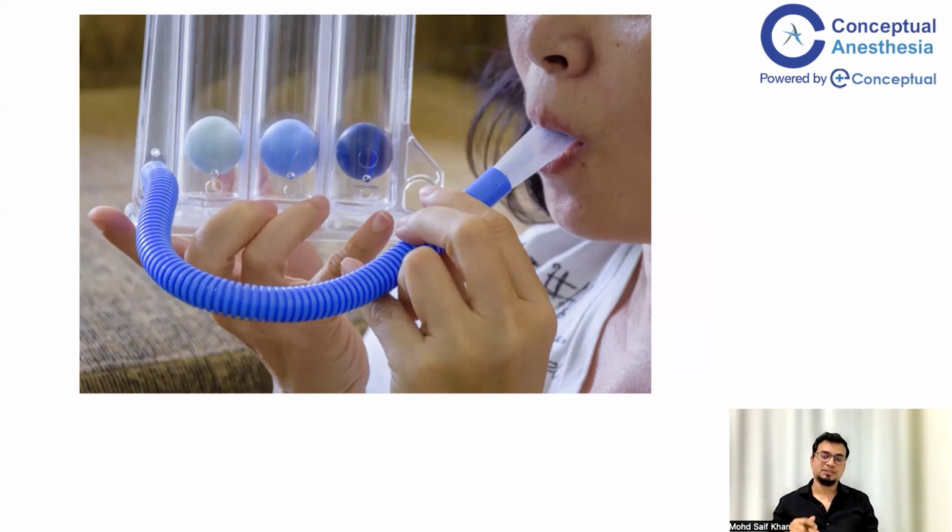This device is to encourage the patient's lung capacity, especially after extubation, liberation from mechanical ventilation, after extubation of the trachea in critically ill patients or patients who have just finished major surgery.